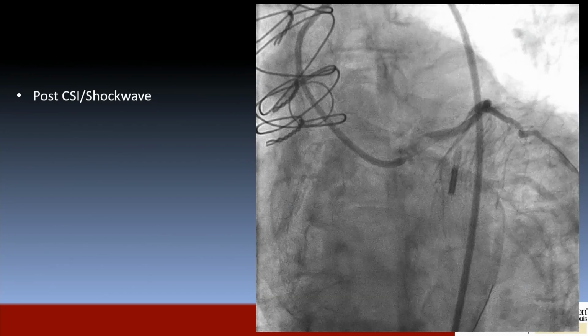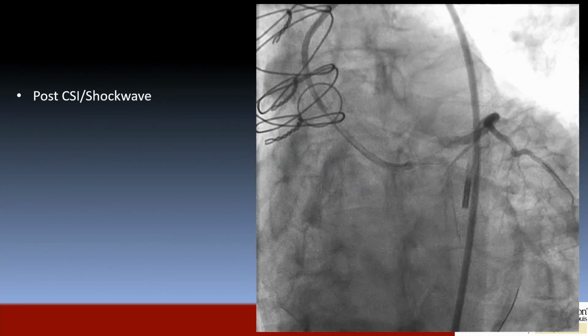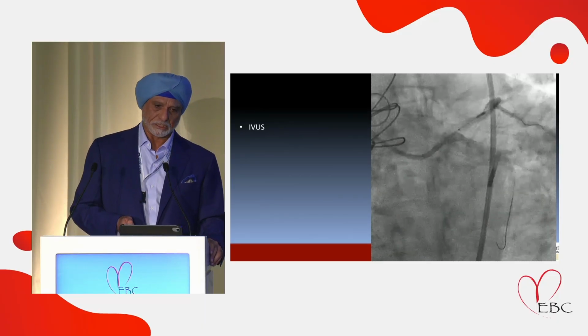You can see, now you can see the calcium is broken. You never saw that. It's like a filling defect. It looks like clot, but it's literally a broken up calcium that you see on angiogram. And we IVUSed it here.